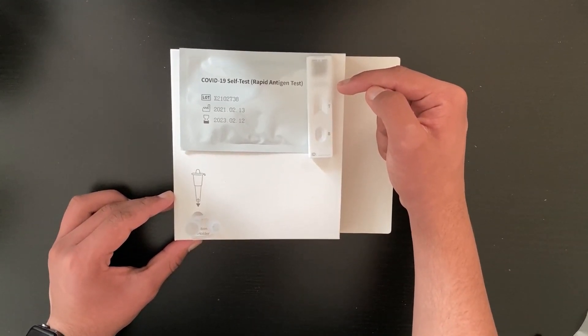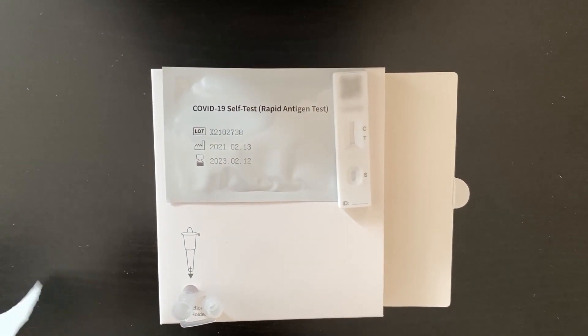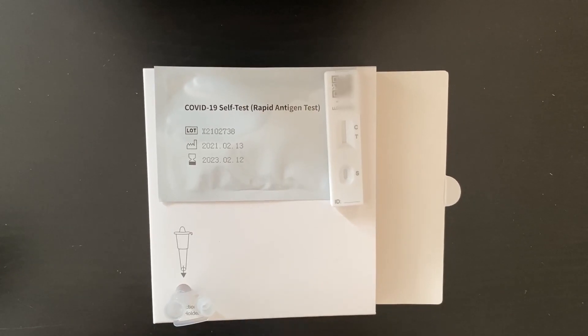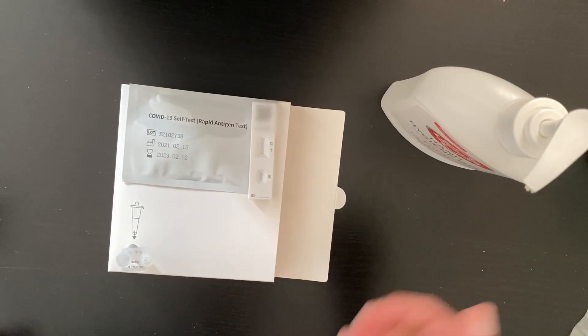Now you need to blow your nose using a tissue, and then sanitize your hands again.